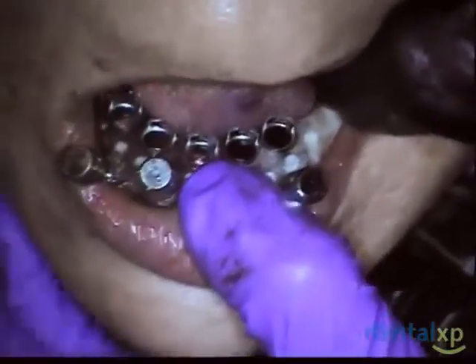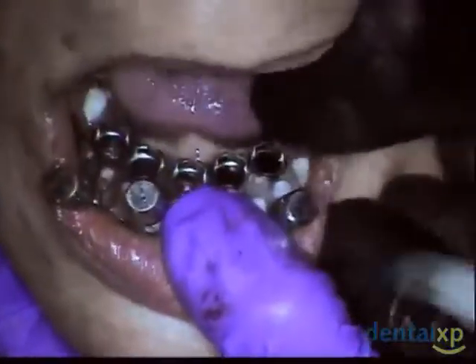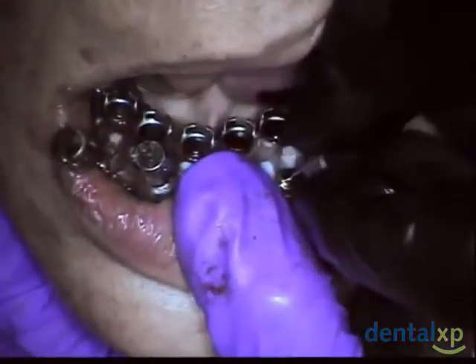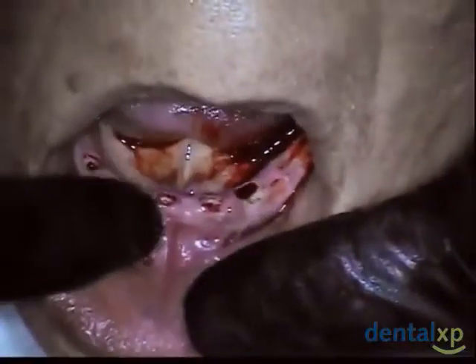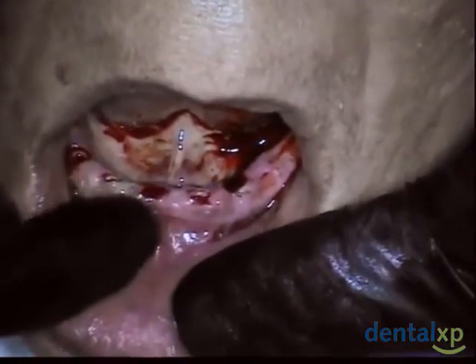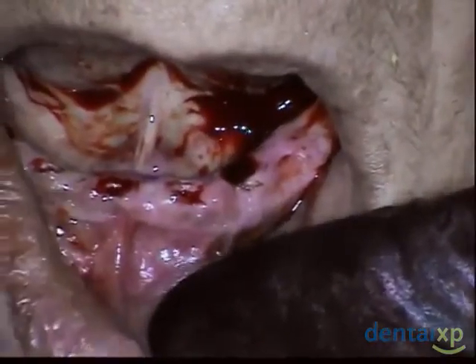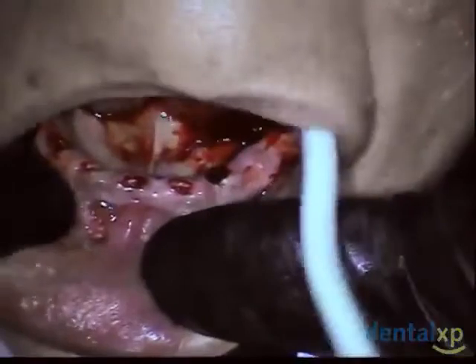Now, if you notice, this is the countersink with the 1.6 burr. So I went into all the sites with the 1.6 countersink, and I may have to go back in with the 2.4 countersink, which is what we would use for the larger implants. So you can see here, I think readily, that we're getting close to our attachment here, so I may make a slight incision here to protect the buccal aspect of our attachment, just so that we can go ahead in this specific site, the midline site, so that we can maintain our attached tissue. Everywhere else, you can see that we have adequate attached tissue, and we won't need to go and do that.